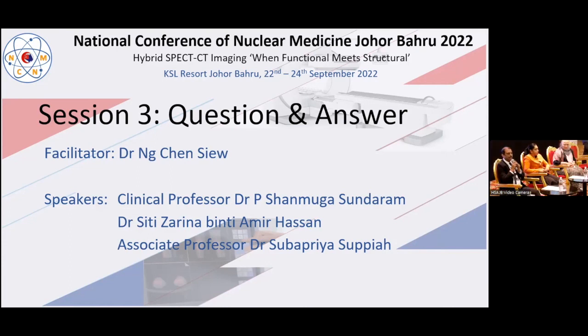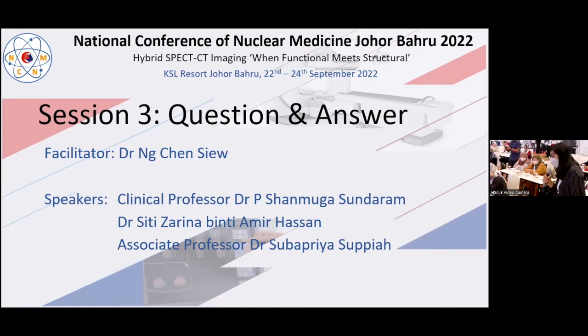Yes, Dr. Priya. Oh, hi, everyone. I have a question to ask you. In the center where I'm practicing right now, we only have planar and SPECT. So in a case where there is coexisting thyroid pathology and parathyroid adenoma, if I were to use only this scan, is there any modification that I can do to differentiate between these two? Because I do understand that the retention in thyroid pathology is longer. So is there anything I can do to include outside of this?